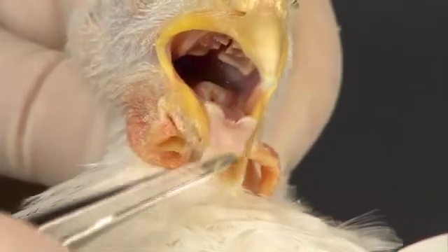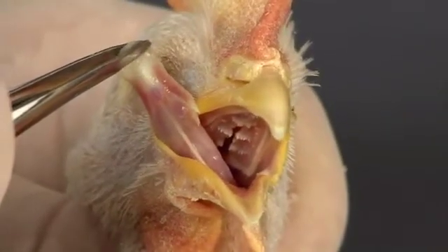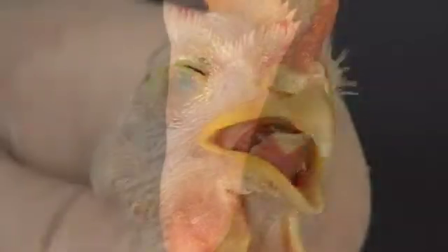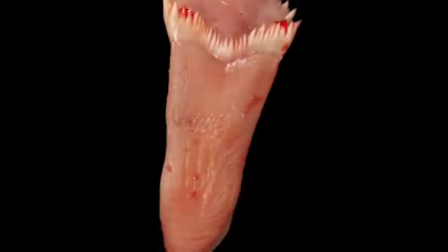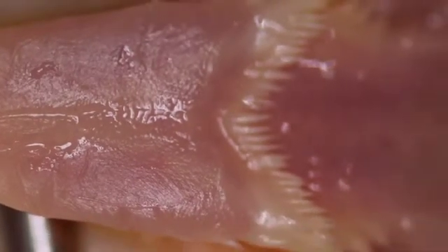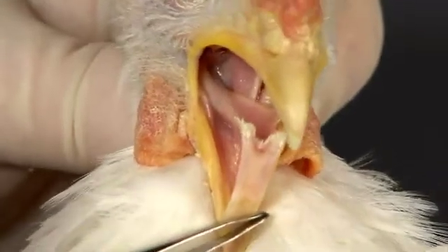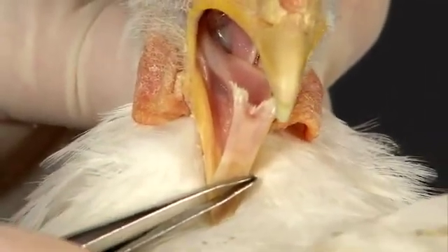Open the mouth and examine the oral cavity. Pull out the tongue and examine its dorsal and ventral surfaces. A bird's tongue is supported by the hyobranchial apparatus, making it somewhat inflexible. The dorsal surface of a chicken's tongue is smooth, and there is a row of large papillae near its caudal attachment. Inspect the tongue for any lesions, such as ulcers or nodules.